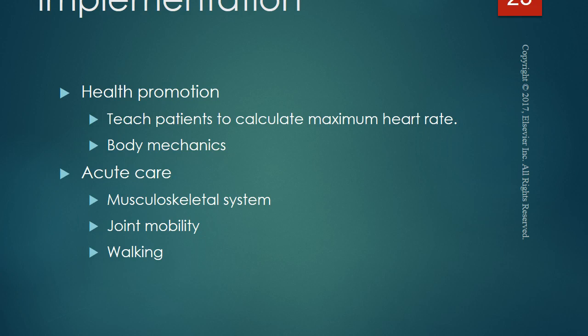Coordinated muscle activity is necessary when positioning and transferring patients. The most common back injury is strain on the lumbar muscle group, which includes the muscles around the lumbar vertebrae. Body mechanics alone are not sufficient to prevent musculoskeletal injuries when positioning or transferring patients. Before lifting, assess the weight to be lifted. Determine the assistance needed and evaluate available resources. You want to use safe patient handling equipment when the patient is unable to assist with the transfer.